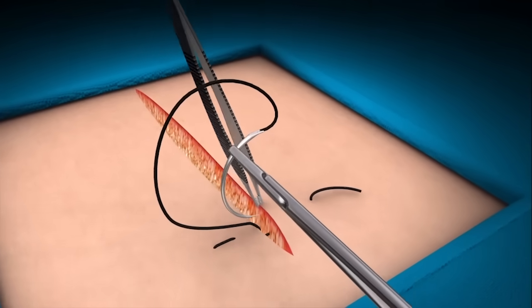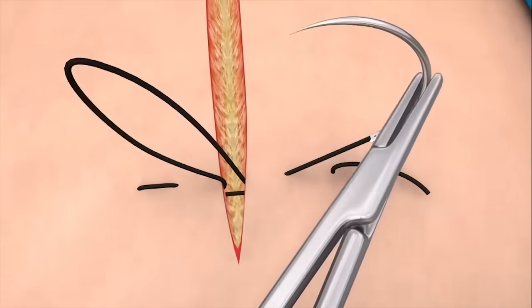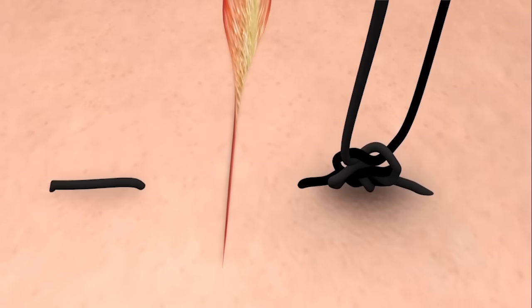Repeat on the opposite side of the wound from inside to outside. Pull the suture through and then tie a standard knot without excess tension.